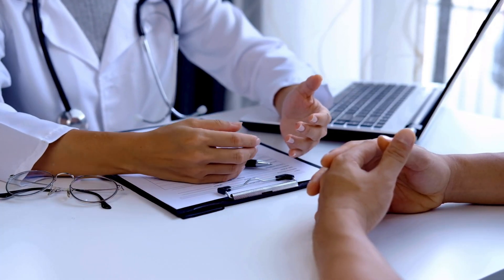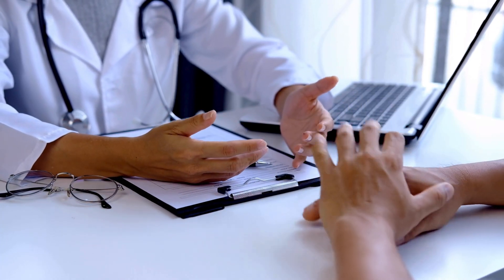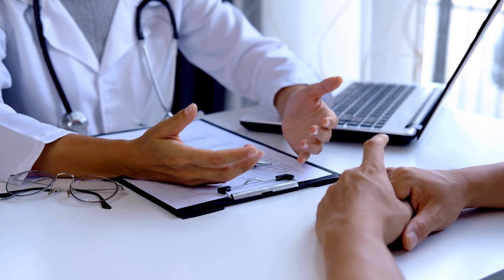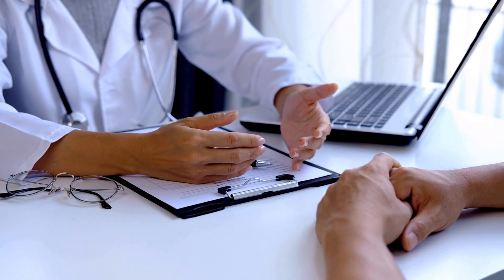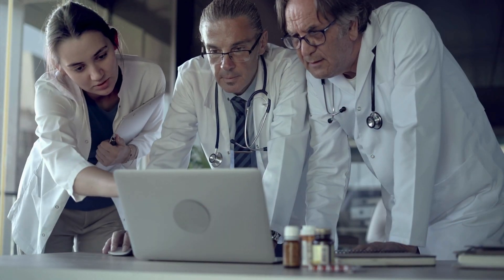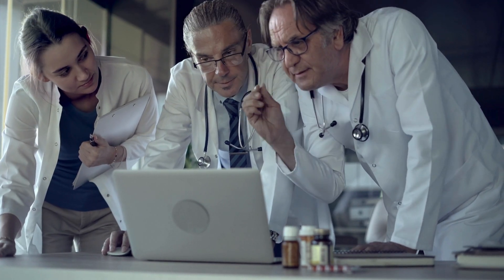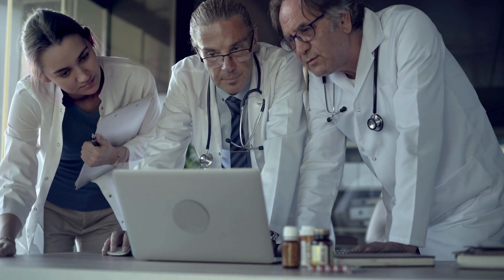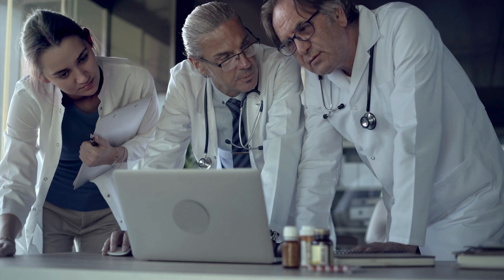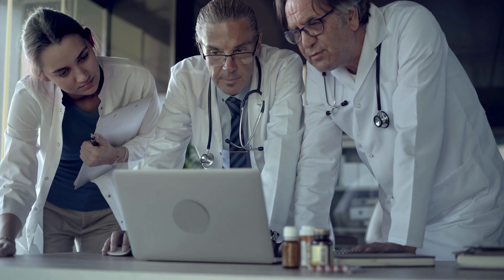Choosing the right heart stent is a decision best made in consultation with your healthcare team. They will evaluate your medical history, assess the severity of your condition, and consider various factors to recommend the most suitable stent for your individual needs.